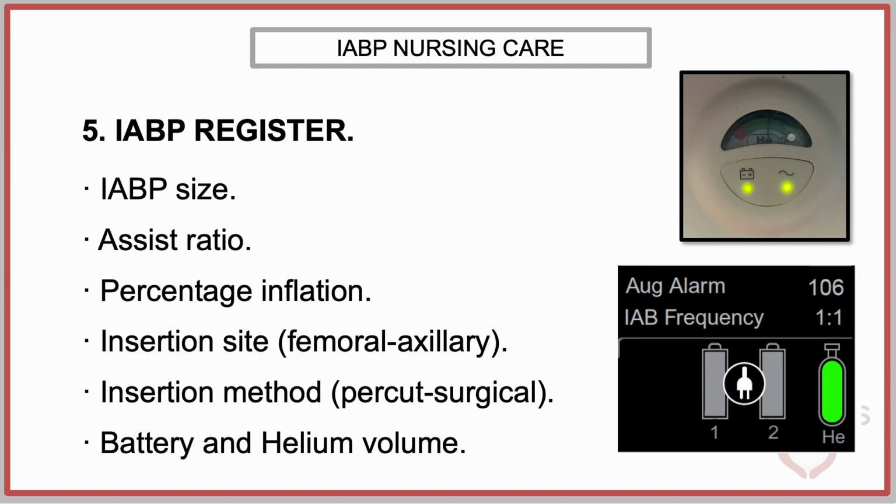In addition, the helium level available for balloon inflation should be reviewed to ensure that it is within an appropriate range for continued operation. The console interface typically provides visual indicators or alerts regarding the helium status, which should be verified as part of the initial equipment check.